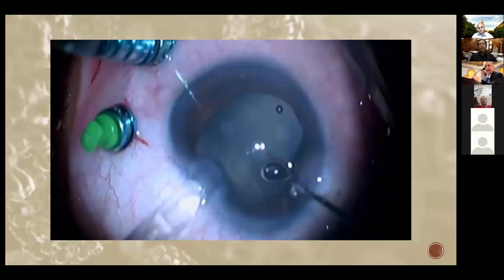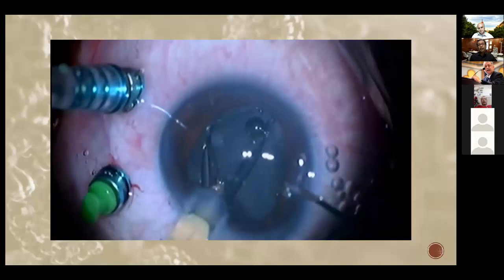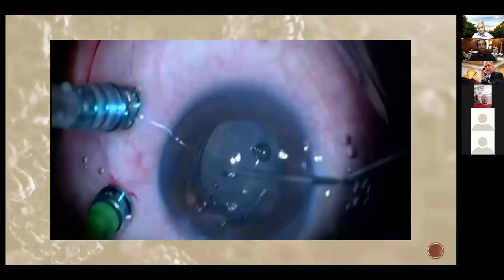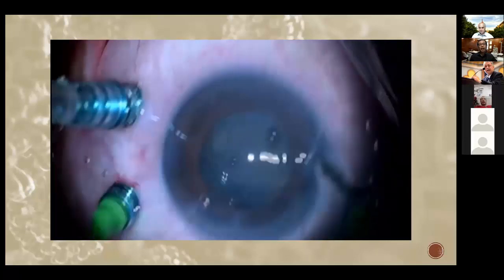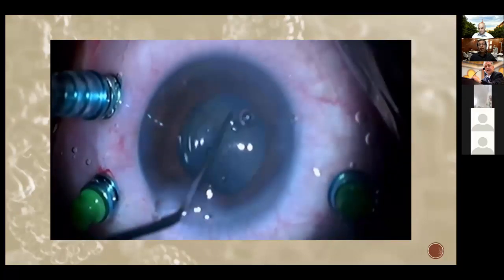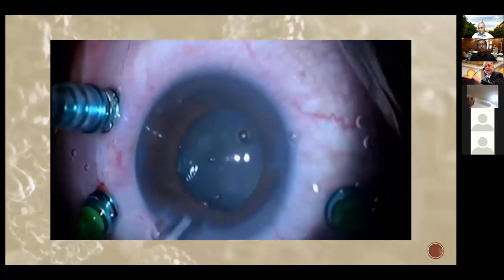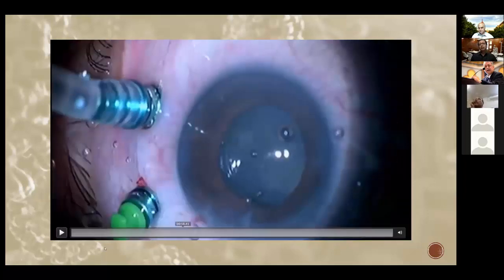And now I implant my lens. I'm very careful with my lens. I have increased the access opening especially for the implantation rather than just the phaco. And now I implanted the in-the-bag IOL. Still, I'm very confident with my surgery because I know if anything happens, I have access to the posterior segment. I can go and get any nucleus that drops. I can go and get any IOL that drops.